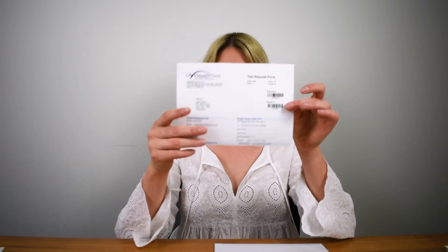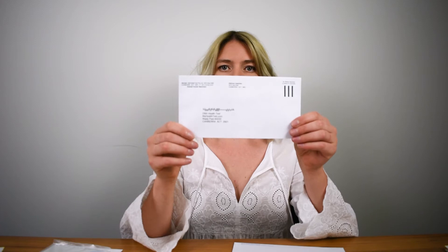Once your sample collection kit arrives in the mail it should look something like this, and it should contain a test request form — this is to fill out and give us authorization to process your sample — a sealed sample collection kit, and a reply paid postage envelope to post your sample back to our lab.